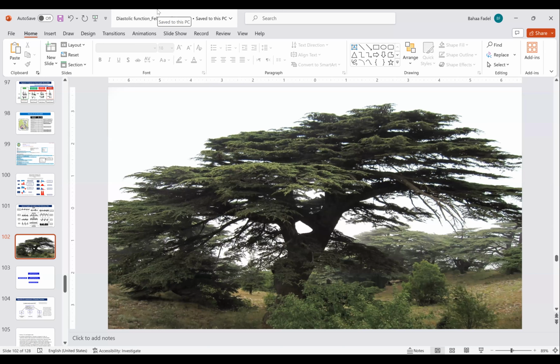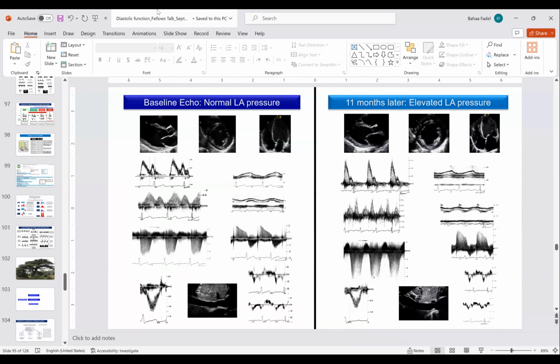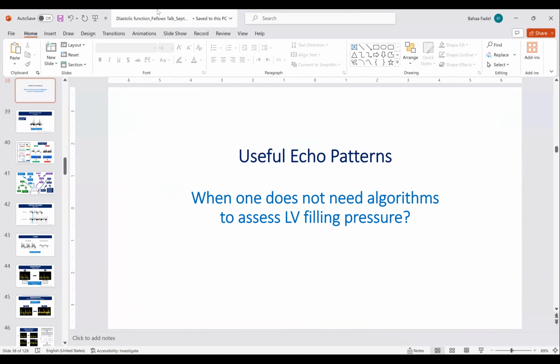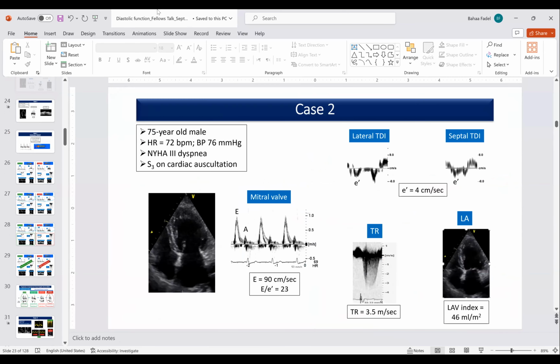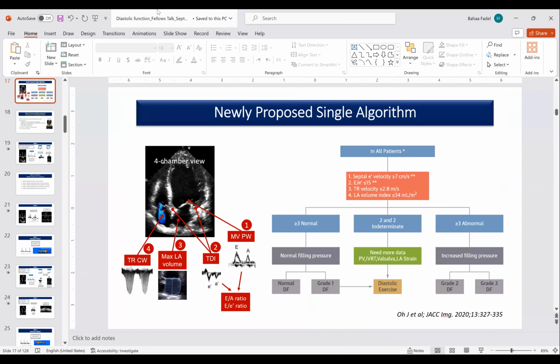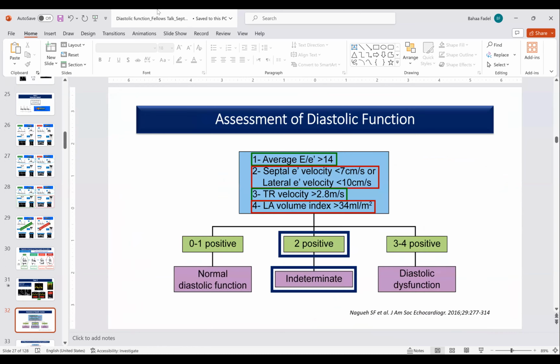And what's your preferred parameters for AF for diastolic dysfunction other than E to E prime? Will you rely on deceleration time, or other things you like? Well, it depends on your ejection fraction. I'll take you back to the slides I was showing about ejection, about patient. Yes, because I went to those guidelines and it was really difficult to get the readings, as you mentioned. Yes, absolutely. I mean, the guidelines are really not very good for this.